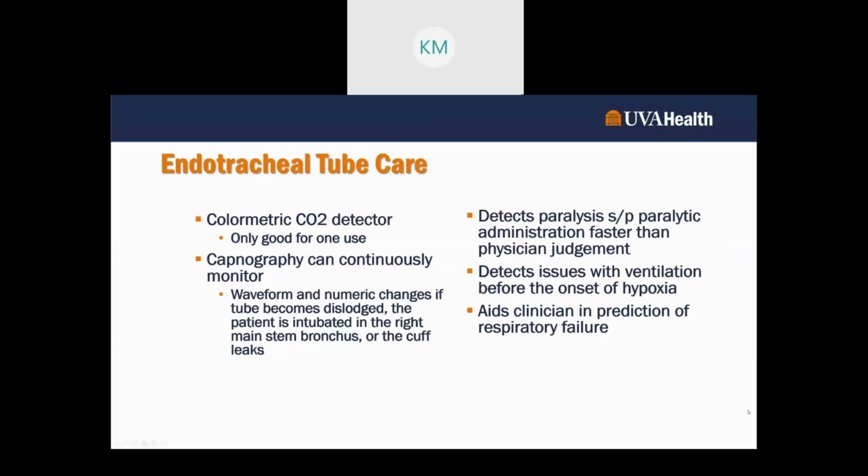Moving on to our intubated patients. I work in the ED, and typically what my physician will use first is a colorimetric CO2 device once they intubate someone. That's really great. It gives you a pretty quick reading: purple is poor, Barney is bad, yellow is yes. I know whether or not I'm in the right place, but it's a glorified piece of litmus paper. It's only good for one use. So, one and done. Okay, I see where it is.